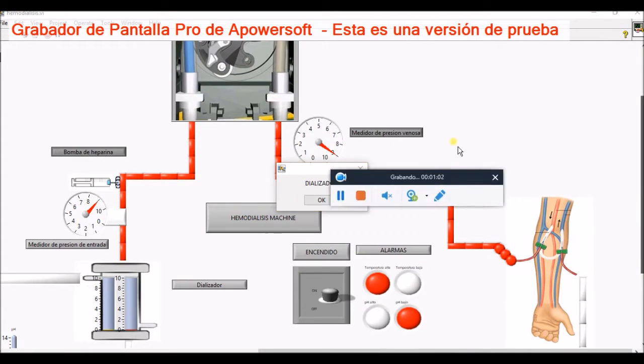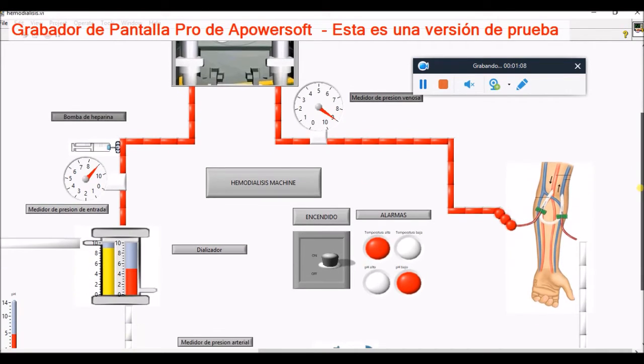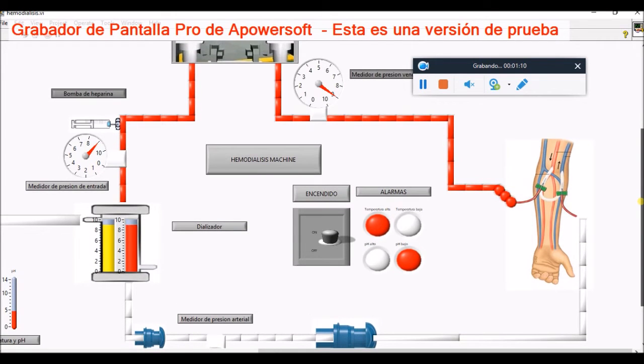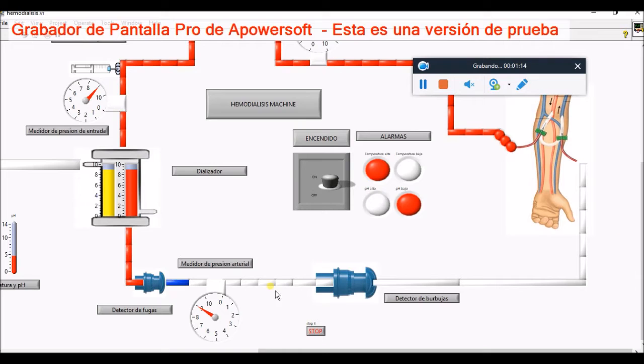Temporary catheters are indicated in patients who are likely to be on dialysis for only a brief period, are too ill to undergo placement of a permanent catheter, or have limited access options. Temporary catheters vary in size and are typically uncuffed and untunneled.